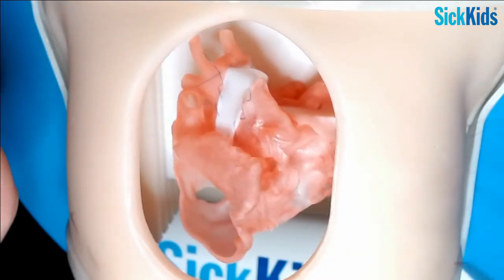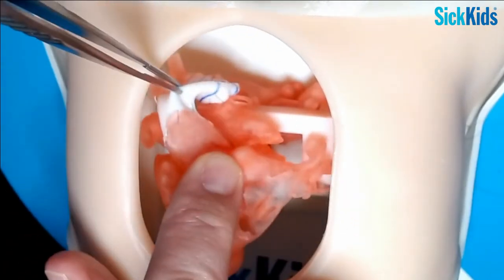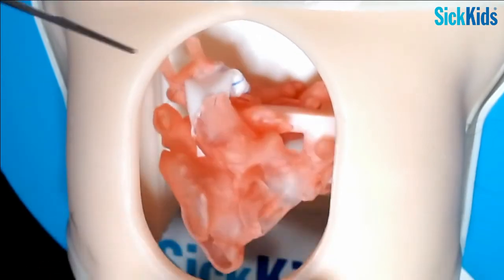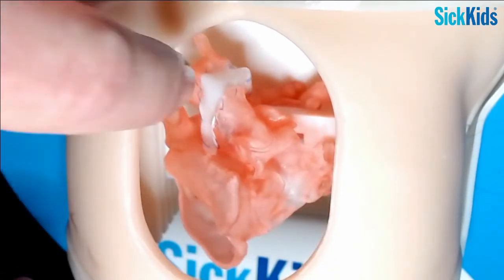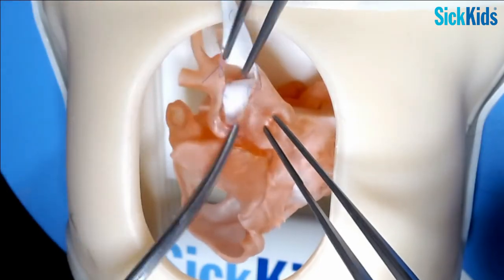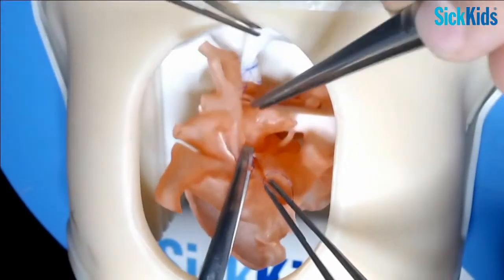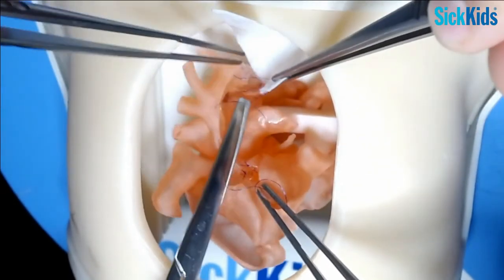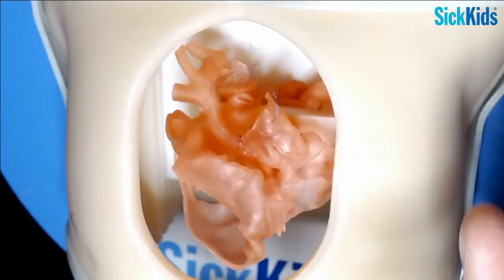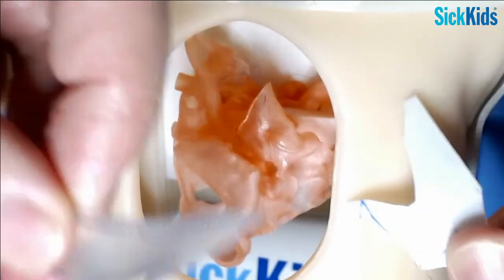Anybody have questions? And you can look at this, you can see it's a non-obstructive arch. It's got a curve. So let's take it out. Let's look at what the patch looks like compared to the beginning. This is what you cut yesterday, so that's probably what we started with. So here's the patch compared to a rough estimate.